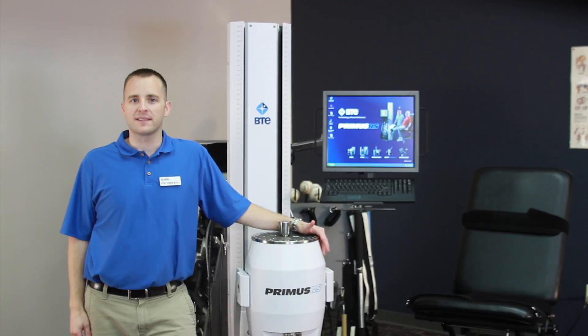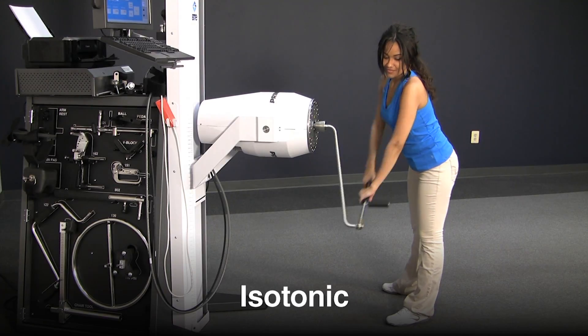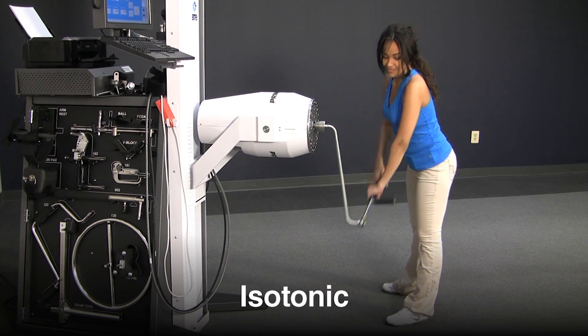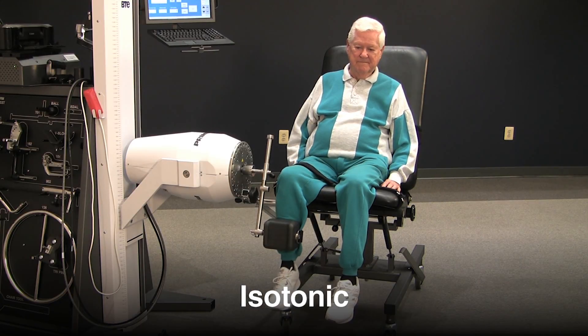Primus provides all the modes of resistance for meeting individual patient needs throughout rehabilitation. Isotonics is how we interact with our environment in everyday life. It is a resistance mode that best simulates how we move and how gravity affects our movements.